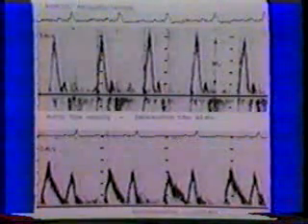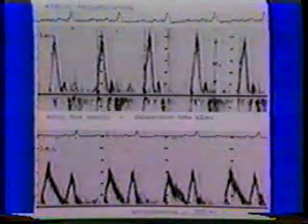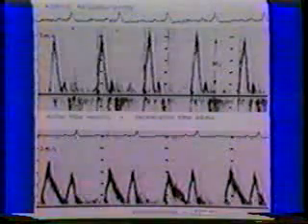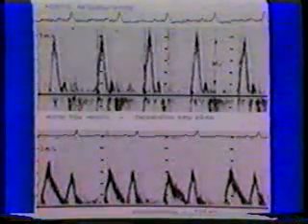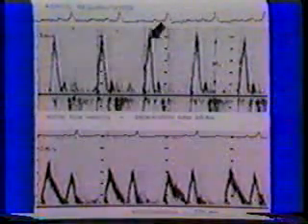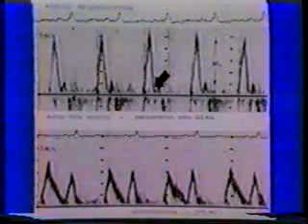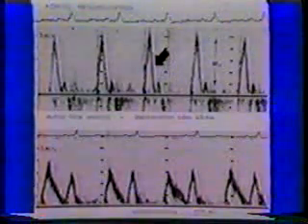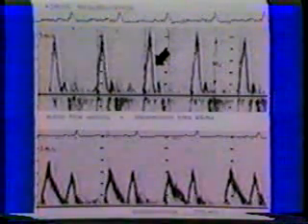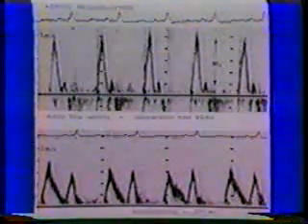As previously mentioned, severe degrees of aortic regurgitation cause a rapid and marked rise in left ventricular diastolic pressure. This not only contributes to a shortened pressure half-time of the aortic regurgitant signal, but also causes a marked decrease in the deceleration time of mitral inflow. The deceleration time here is 85 milliseconds. Normal for adults is greater than 160 milliseconds.